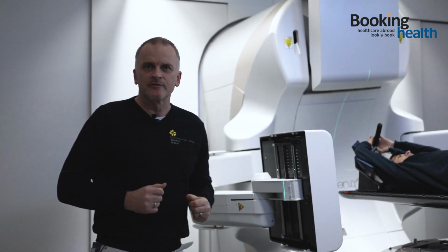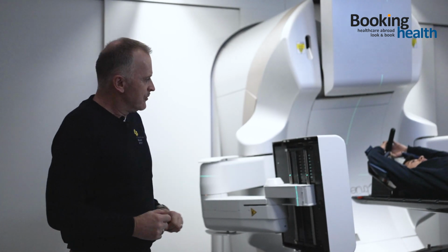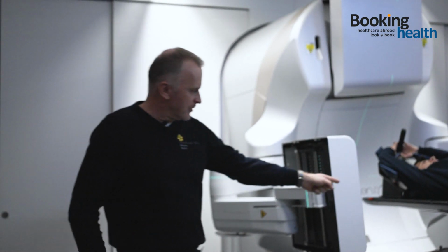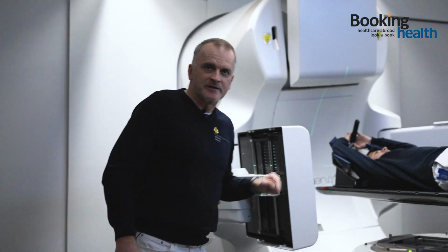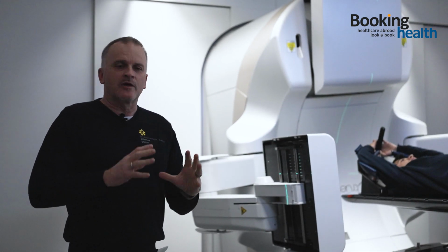tumor irradiation. When a doctor has the necessary imaging data and can clearly see that the tumor is in the correct position, the irradiation procedure begins. The rays from the device are directed toward the pathological focus from top to bottom. A large number of tiny plates are built into the device, namely about 120. While the device rotates around the patient, beams are formed, which are eventually directed to the tumor to destroy it.